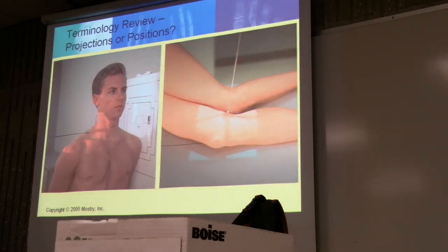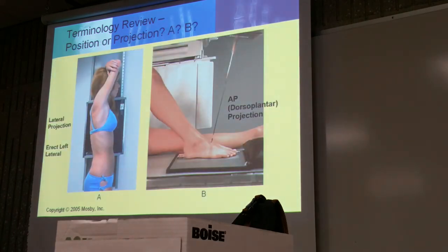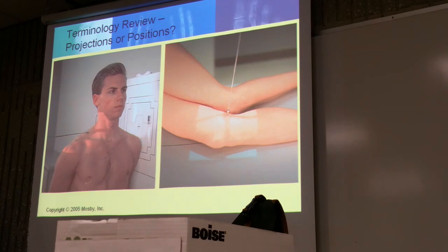So it's axial if it's not perpendicular to the image receptor. Okay, what's this? What's the neck? Left lateral. What about that one? Medial, lateral projection. What's the position? Is it modified Sims? No? It's just a lateral knee. So it's a right lateral knee. Is there any deviation from the central ray? Is it straight up and down? Or just a slight angle? So there's an axial projection to that, yes. Okay, that's axial.